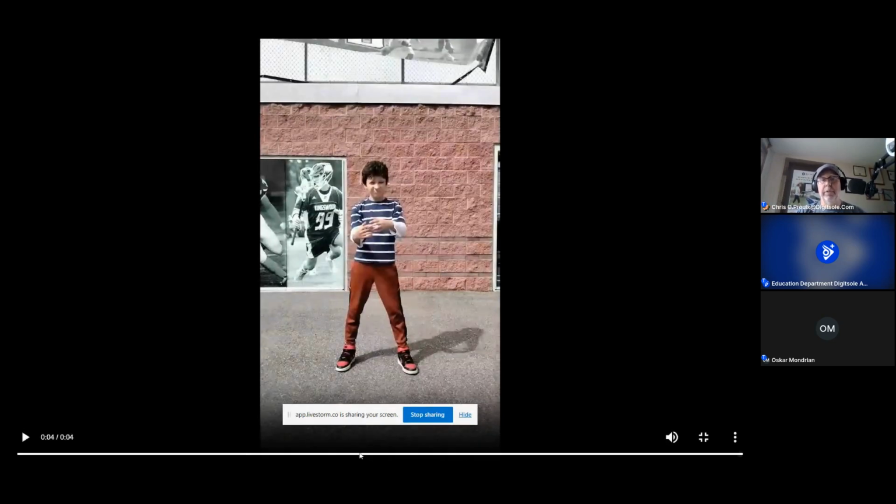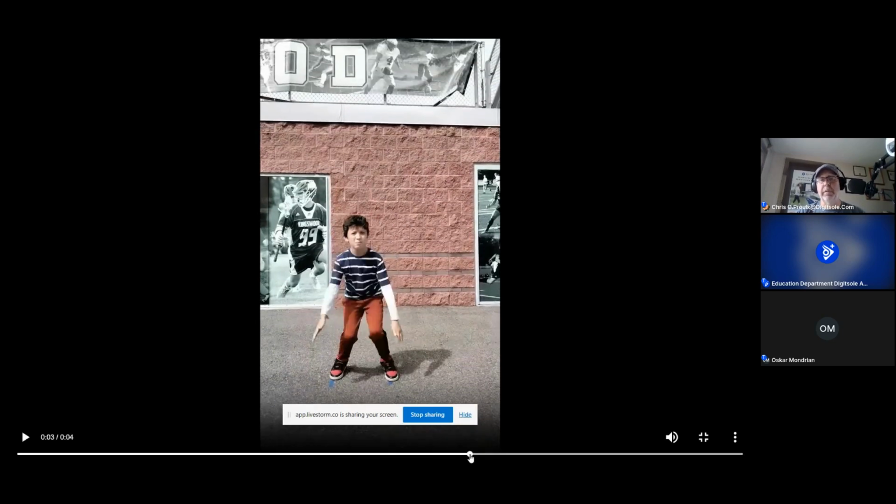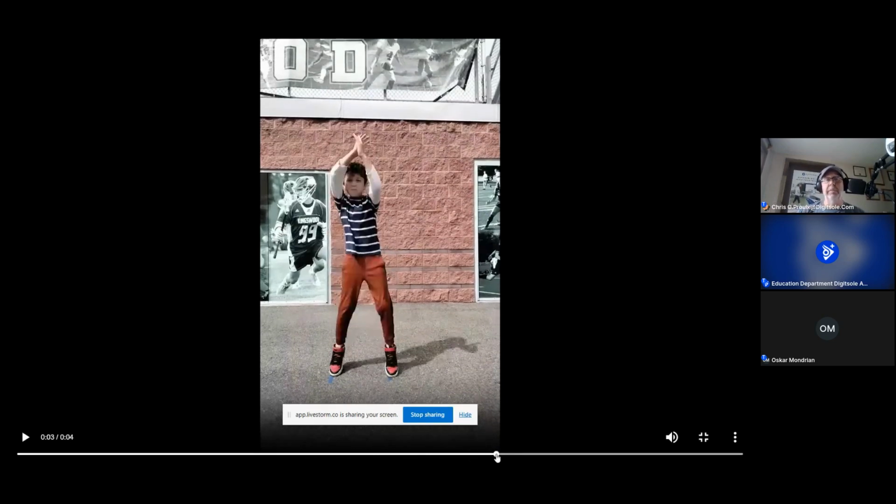And you can stop and start at different points and look at maybe right before takeoff or right before landing. Again, you can see some of the characteristics of his knee joint position. If you wanted to evaluate timing, we know there's a timing effect in terms of shoulder elevation and forward arm motion with regards to him maximizing his capability of performing this vertical jump.